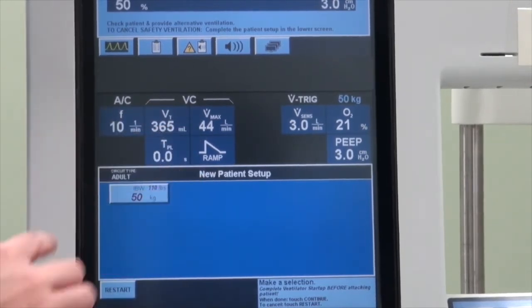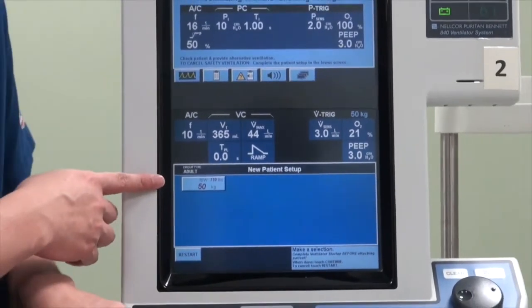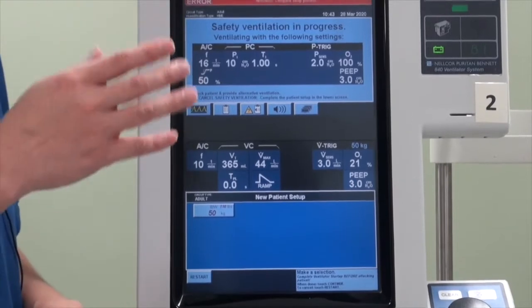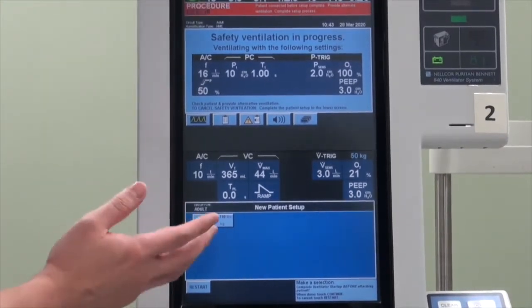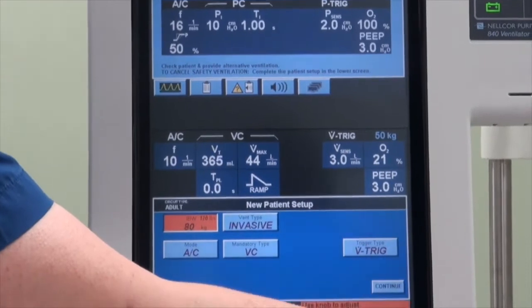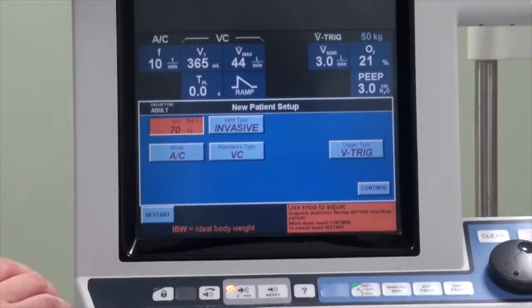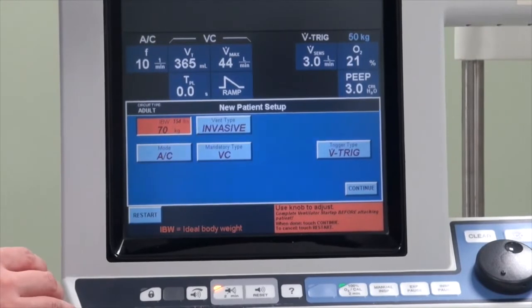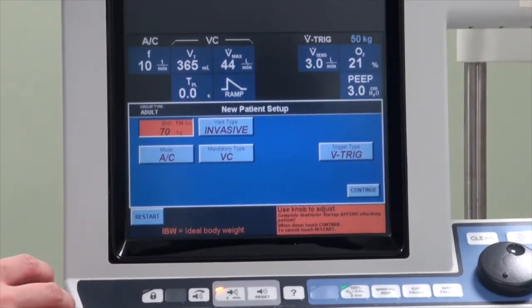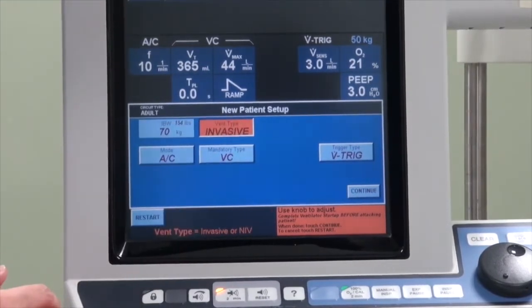When this is connected, the first thing it will tell you is to key in the patient parameters. The important parameter is the patient's weight, which is the ideal body weight based on the patient's height and gender. Assuming that this patient has an ideal body weight of 70 kg, you can press the button and turn the dial to select the value. You will also note that once this is selected, other options will come in, allowing you to select whether you are going to put this patient on invasive or non-invasive mechanical ventilation. For today's demonstration, we are selecting invasive mechanical ventilation.